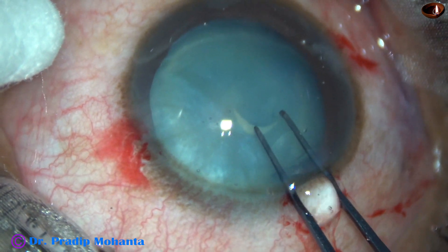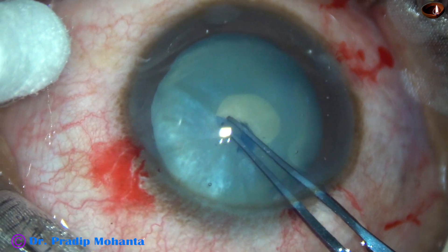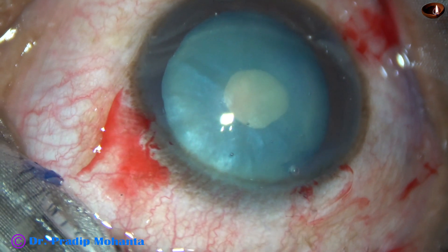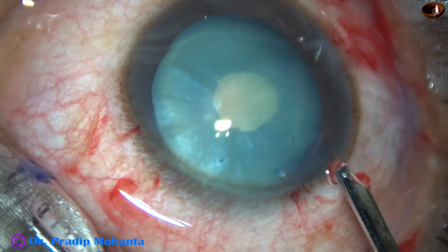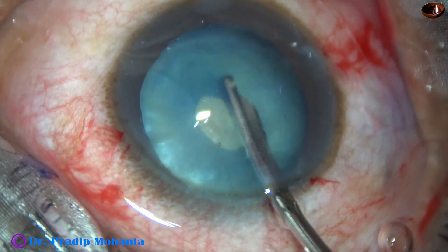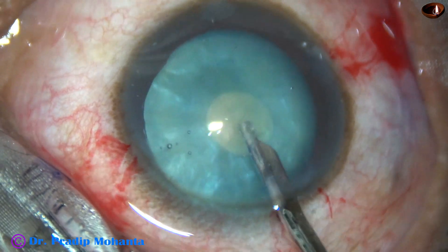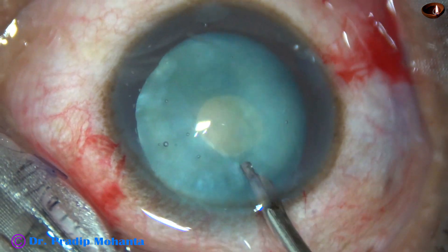There is some amount of intumescence in this case. In such cases, I always do a two-staged rhexis: first a mini rhexis, and then after aspirating some cortical lens matter, I enlarge this mini rhexis into an optimum-sized one. My approach is not to use sodium hyaluronate in such cases — though I am not against it — but I never use sodium hyaluronate to get a mini rhexis.